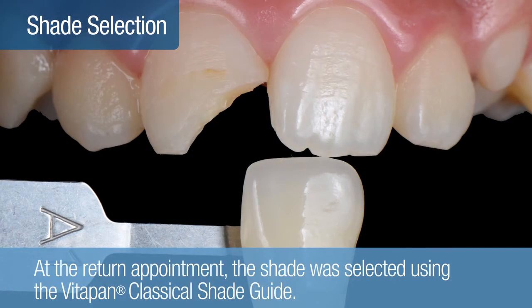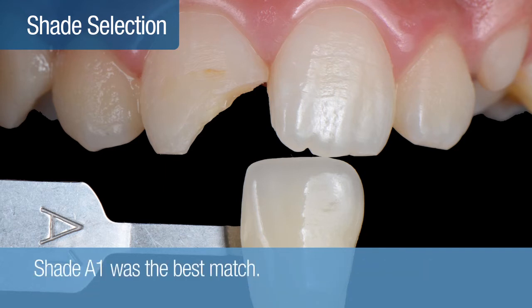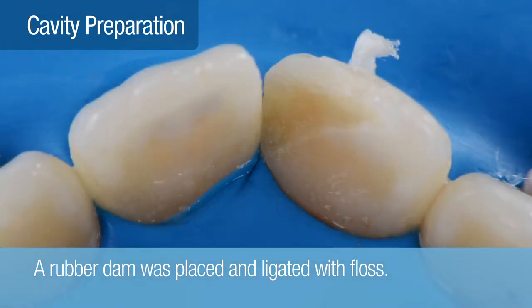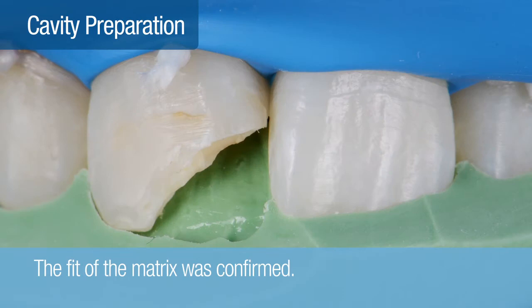At the return appointment, the shade was determined while the teeth were fully hydrated using the VitaPan Classical Shade Guide. In this case, the A1 tab was the best match. A rubber dam was placed and ligated with floss. Once isolation was complete, the fit of the matrix was confirmed.